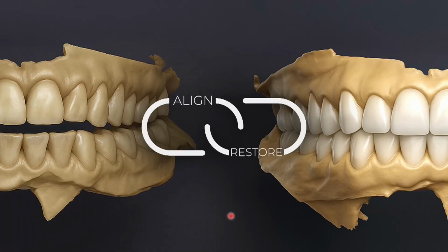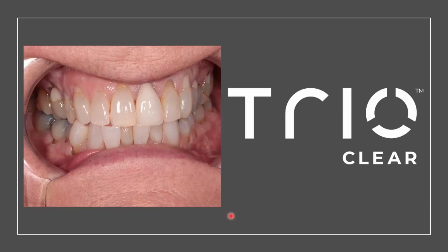Align and restore. This will really help you simplify your cases as well, because at the end of the alignment phase, you'll be able to restore to correct some of the imperfections that often appear at the end of an alignment plan in terms of position.